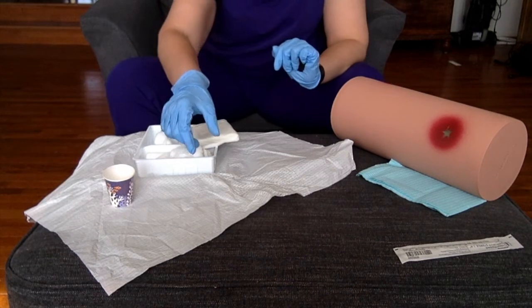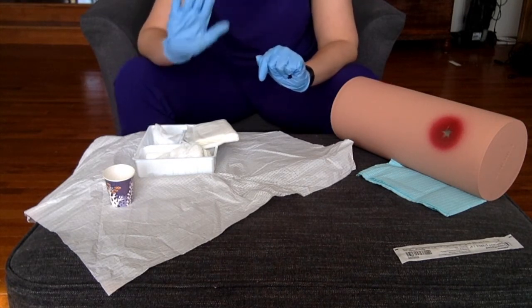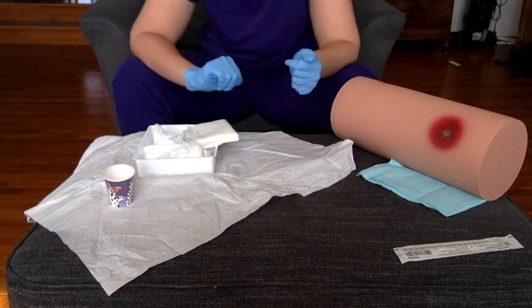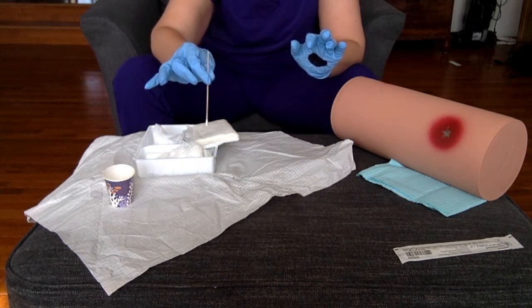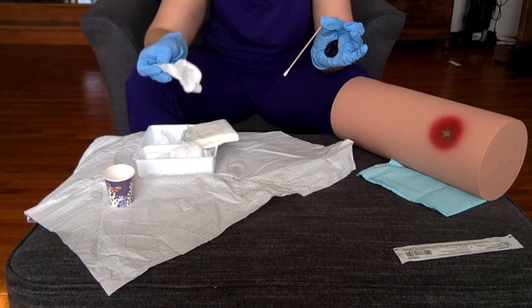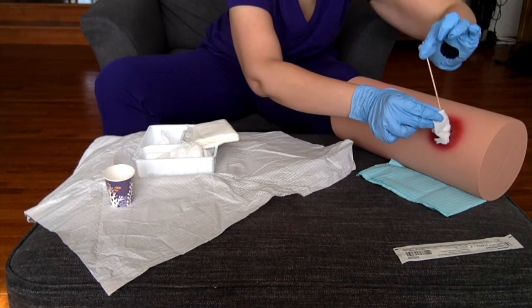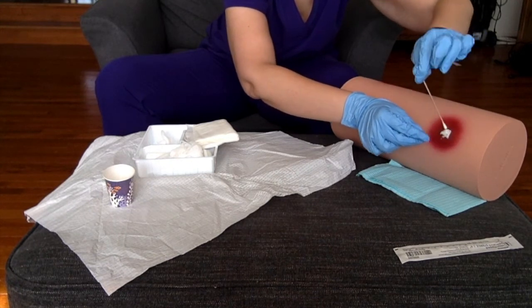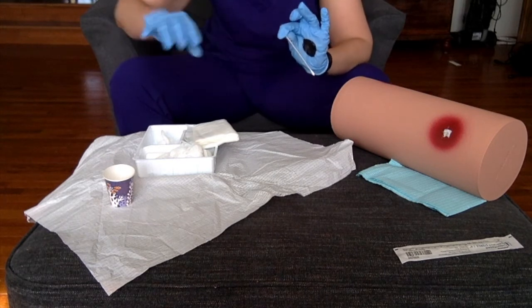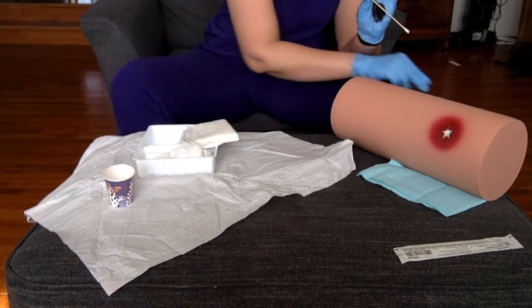The next piece is packing the wound. My order is wet-to-dry, so this hand must be sterile — I don't want the dirty hand to grab the gauze and pack it inside the wound because I might seal in an infection. So the dirty hand assists: sterile hand gets the gauze from the kit, then I hand the end of the cotton-tipped applicator to my dirty hand. That way my sterile hand can hold the sterile gauze going inside the wound, and I use the applicator to control and pack it inside without touching a lot on the outside. On yours you should do a couple of pieces to practice going back into the kit and using the applicator to guide each one in.